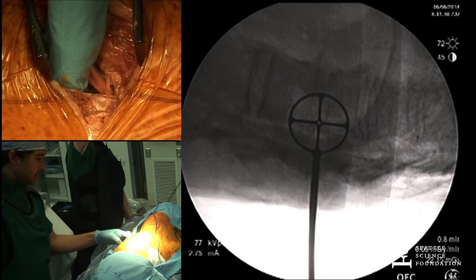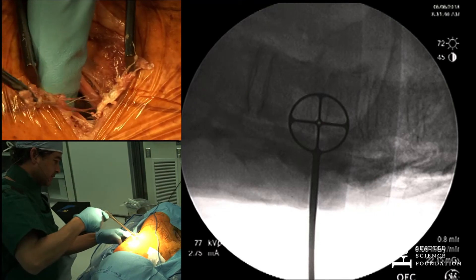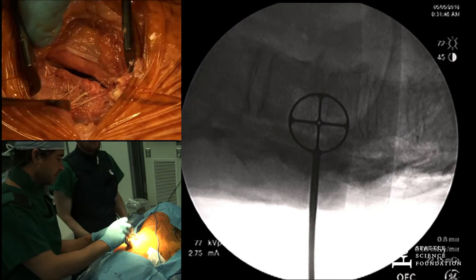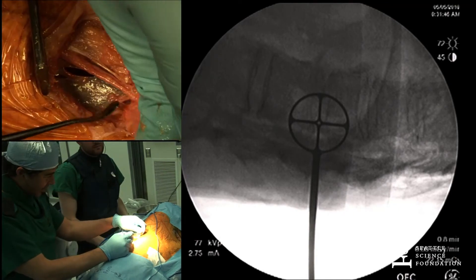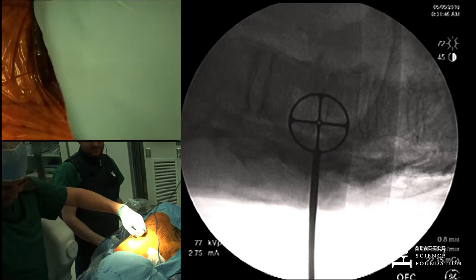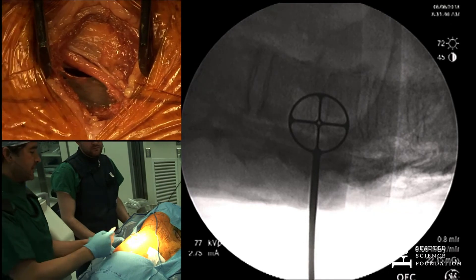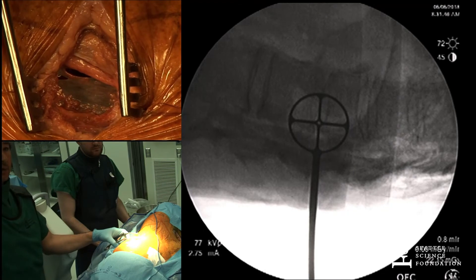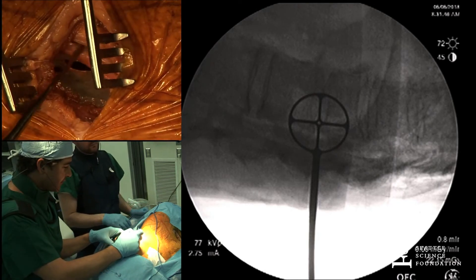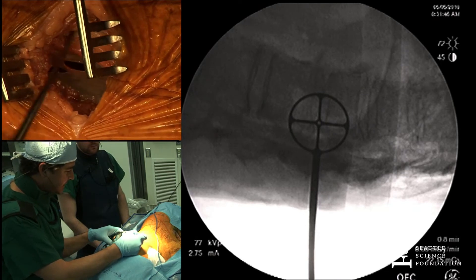This is a great anatomical dissection. You can see the pleura there. Here's the rib — you can see how much access you have now when you take the rib out. We'll use the rib for bone graft. Look — there's the nerve, the artery, and the vein all together. And you can see there's the pleura, and you can see how easy it is to get into it.